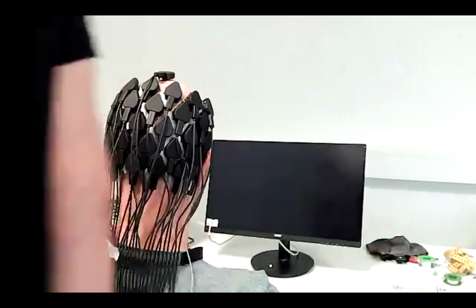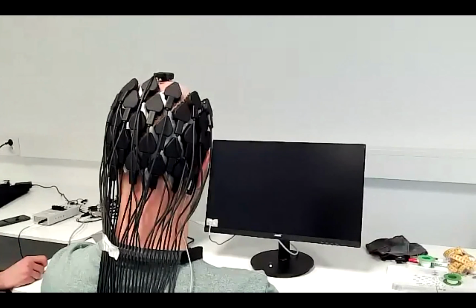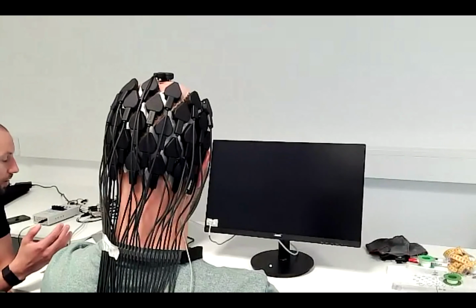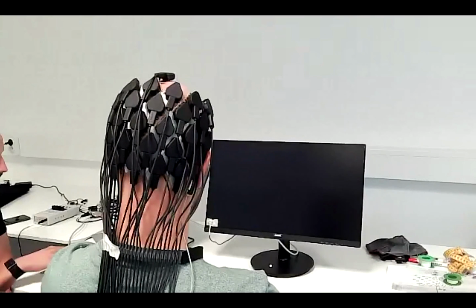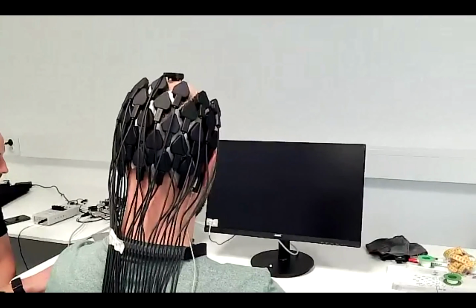So we're running a couple of different experiments. In general, as you've seen before, these visual features that Matteo showed are different bars with colors, orientations and contrasts. But for this experiment, we will just present faces, so faces of known people in the company, and we'll also present some random objects.